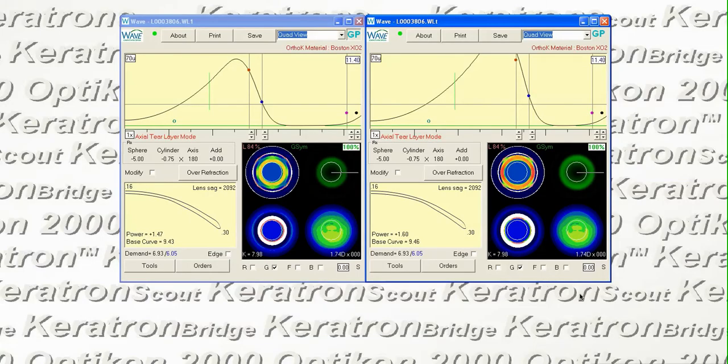The patient's problem with glare at nighttime is going to be a little bit more difficult to resolve, and we probably won't be able to find a lens that completely eliminates the glare. The patient will always have some just due to the optics of ortho K, pupil size, and the amount of OZ we can get with given parameters.